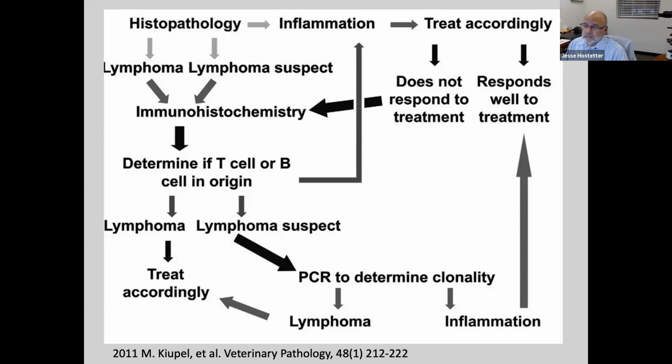The other possibility is it's coming down from gut-associated lymphoid tissue, and that GALT is the major source of that neoplasm, and that's spreading downward into the lamina, into the submucosa, into the muscularis. That's a reasonable hypothesis as well.